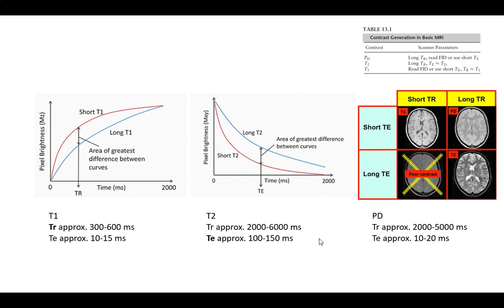Because you look at, for a doctor working with a radiologist who would be an expert on MRI stuff, they'll say what are they suspecting, what are the problems. If you don't know and you're just doing a blind search, they might do a couple of these different things. But that's going to be a really long, expensive test. So in general, you have some suspicions, and so you aim the scans towards the suspicions.